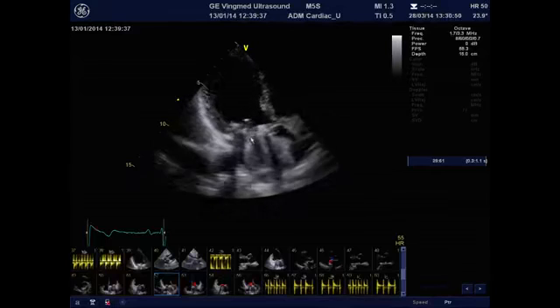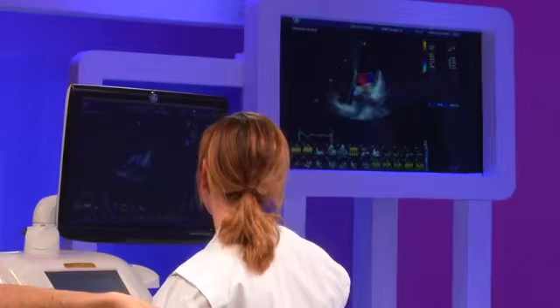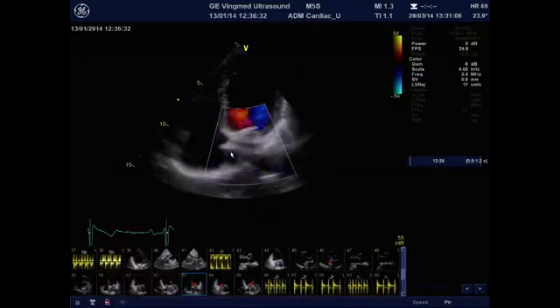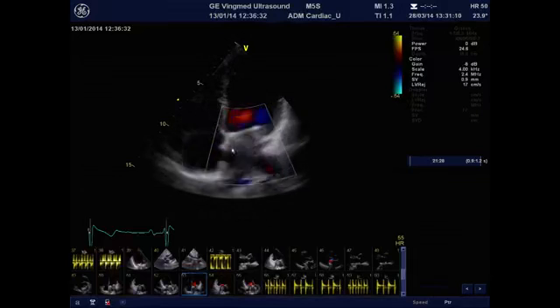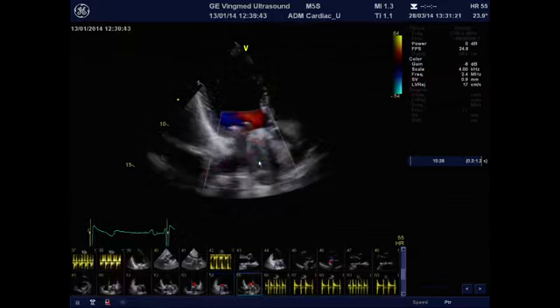After this, we're going to go back in the 4-chamber view, and we're going to add Doppler color flow. Here, you're going to try to evaluate for the presence of pathological leakage. But as I said before, it's really more difficult because of the reverberation and the shadowing. So again, in 4-chamber view, in two-chamber view and in three-chamber view.